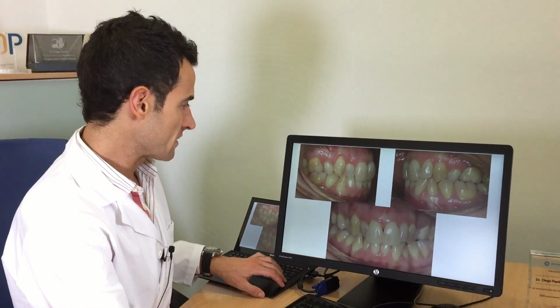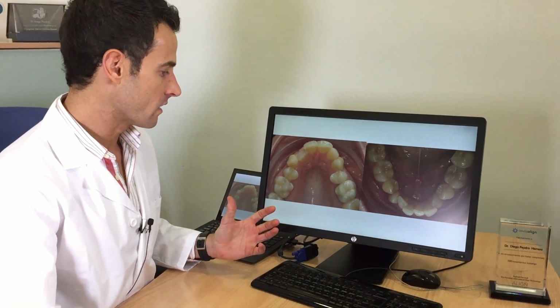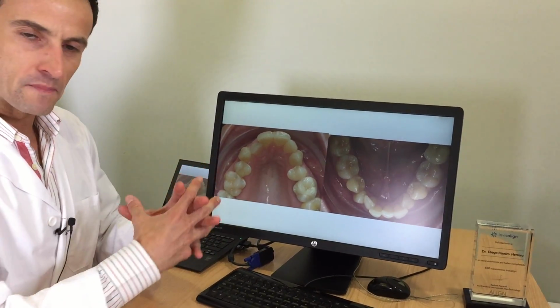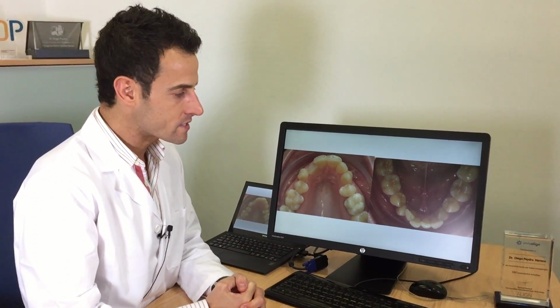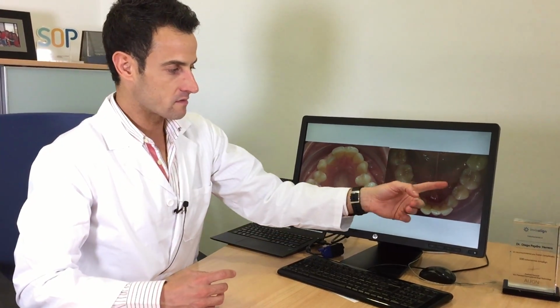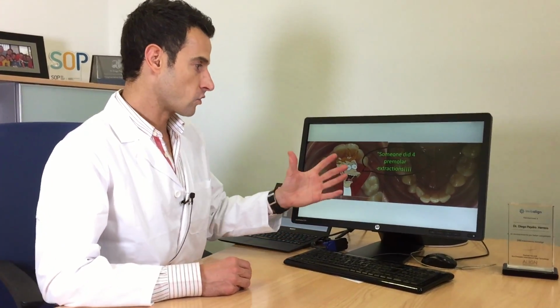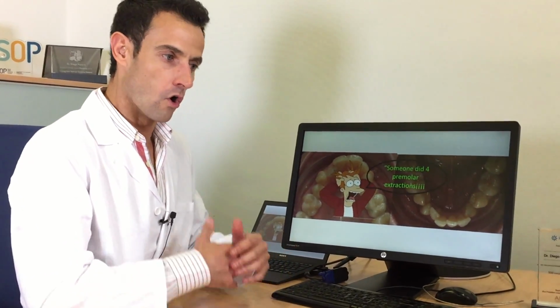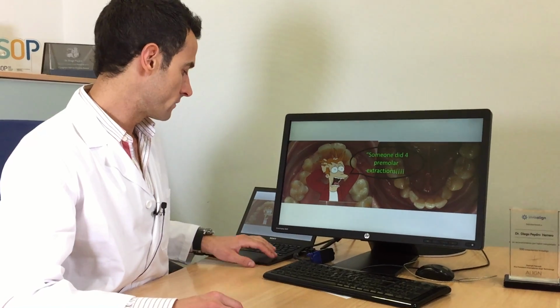And something that is really impressive, look at the arc shape in the lower and the upper arc. As I told you, a big compression, triangular shape. Everything is really compressed, like the teeth are going out of the bones. Look at this, it's really huge crowding in the upper and also in the lower arc. And as I told you, someone did 4 premolar extractions a few years ago, and even with these premolar extractions we had this huge problem.